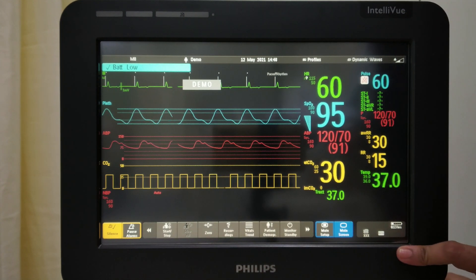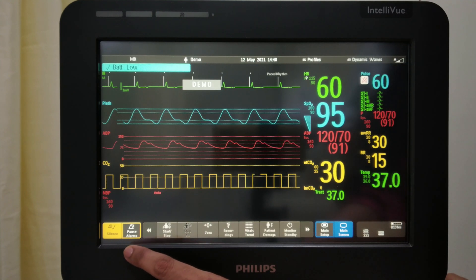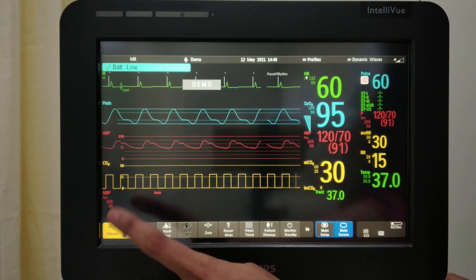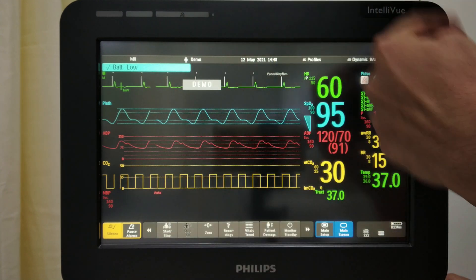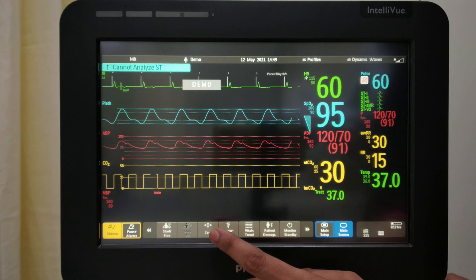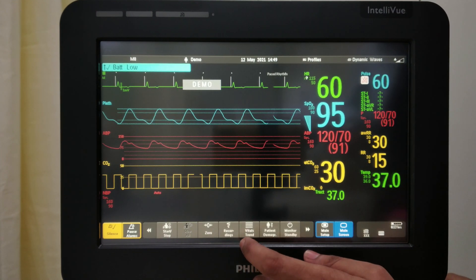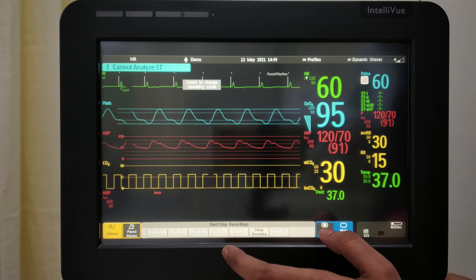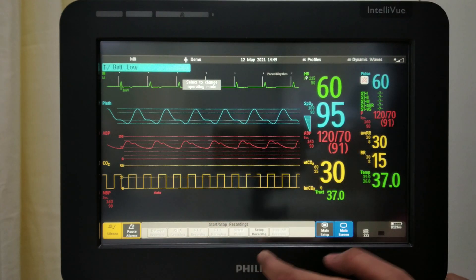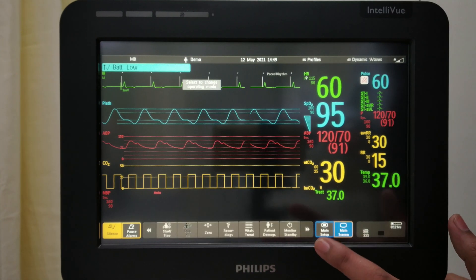This is the lower part of the screen. This button is to silence the alarm. This is to pause your alarm for 2 minutes. This is the start/stop of your NIBP. If you want to stop all parameter readings at once, you can press stop all. Zeroing of the EtCO2 or arterial line can be done here. Then there is screen recording and setup options. If you don't know where to go, you can press main screen.